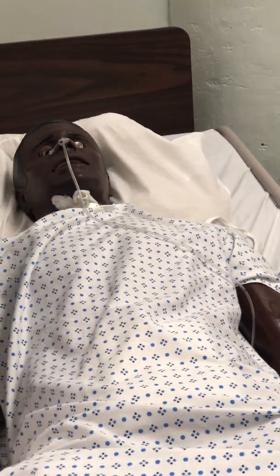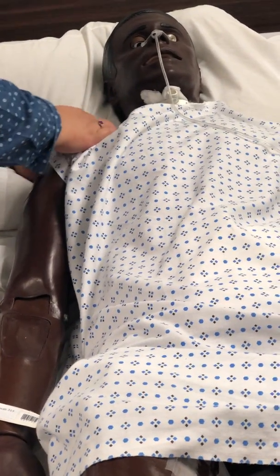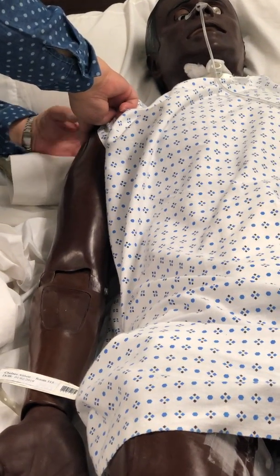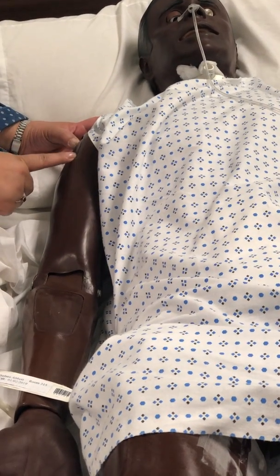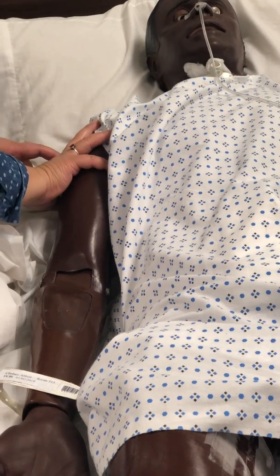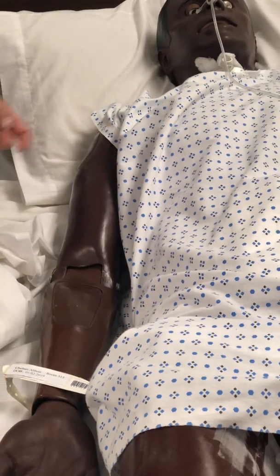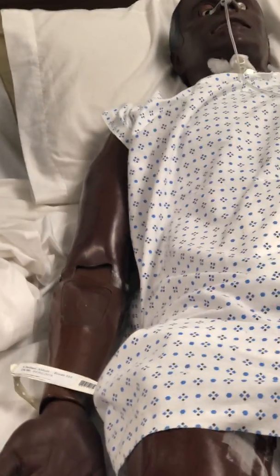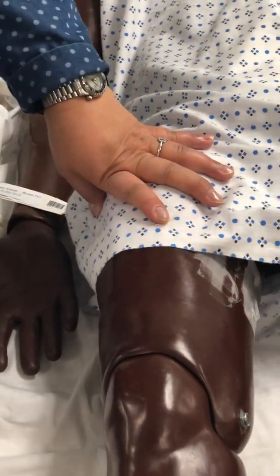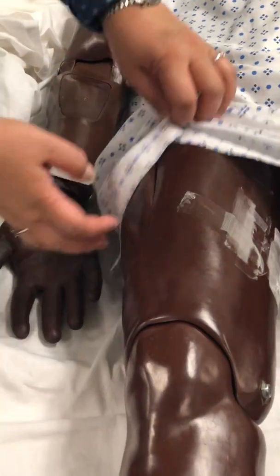All right? So the way to find the deltoid is we will palpate the acromion process. And 2 finger breadths below the acromion process, we will also look for the axillary line. And then we make a V on top of the axillary line and put it in the middle of the V. All right? Do you have any question with that one? Oh, by the way, the sites are in the checklist, the procedure or the steps.